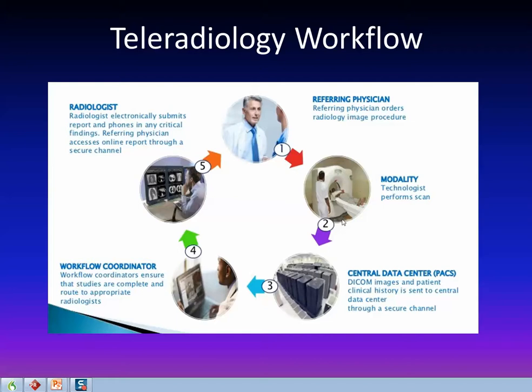Once the images are there, they're going to get transmitted to the data center for storage. Then from storage, they're going to get over to the workflow coordinator who's going to ultimately send the images to the radiologist. Radiologist is going to interpret the exam and then make a report, send that back to the ordering physician so the ordering physician knows what to treat.